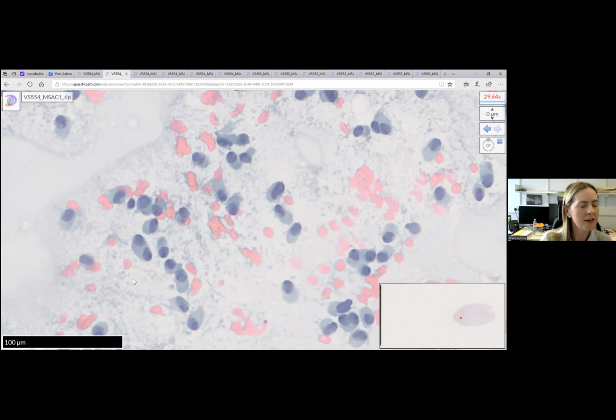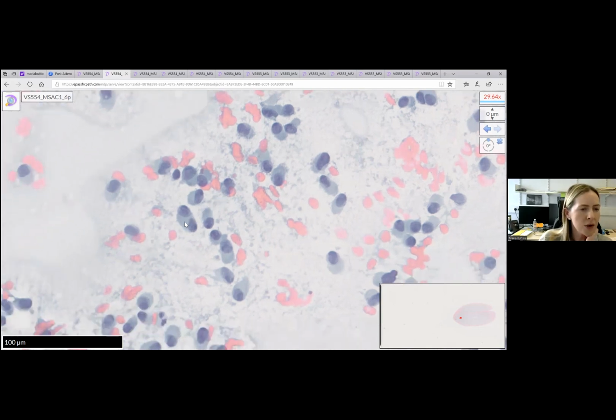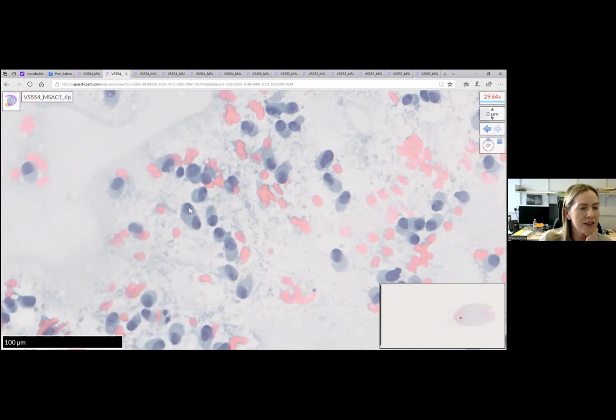But I'll tell you that the answer to this case was melanoma, and I will try and tell you some cytological hints that will allow you to favor one over the other. So I think the main differential here was whether it was melanoma or a metastatic carcinoma. So if it was a metastatic carcinoma, you're most likely for it to be an adenocarcinoma. Although you can get a single cell population in the case of a lobular, and this is a female patient and it's an axillary lymph node, you would expect to see other features of adenocarcinoma.